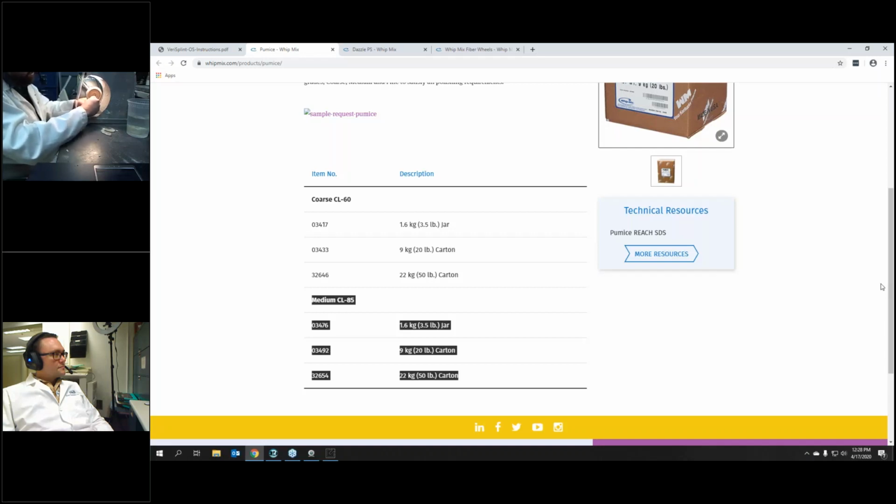Now I'm not pushing really heavily. I'm just lightly running it across it. I'm going to alternate the direction. Oop. Sometimes they fly out of your hands as well. And this material is pretty resilient.